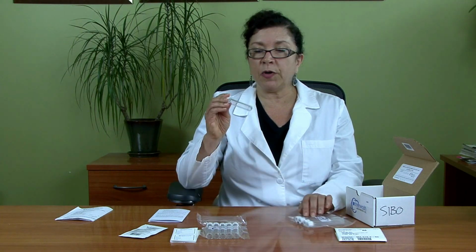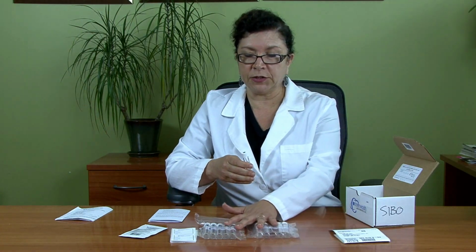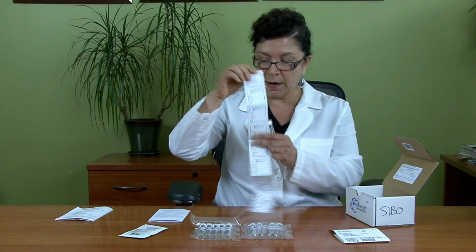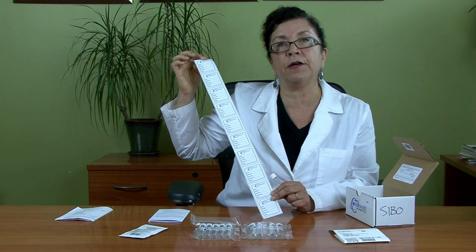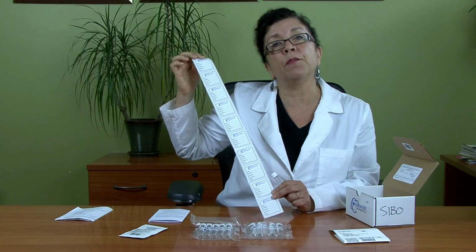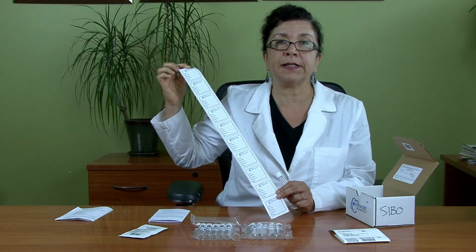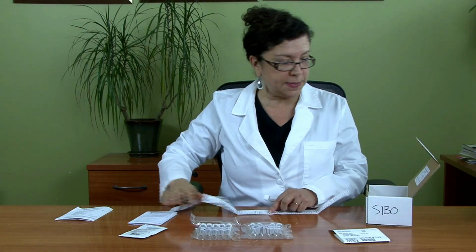Okay, so I'm going to go ahead and pull out a tube. So go ahead and open up the plastic wraps, pull out your first tube. So remember, these are your collection tubes. Make sure you have filled out all of the labels. Put the date, your name, and your provider. Label them 1 through 10, and of course, note the time you collect each specimen and write it down. So let's go ahead and set this aside.